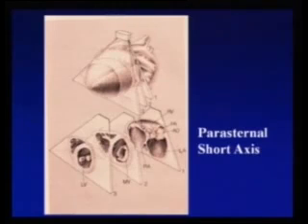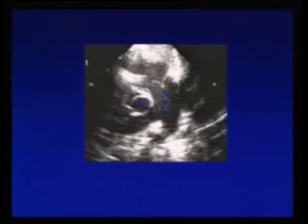The mitral valve has to be looked at in the short axis: is a cleft there or not, is the MR through the cleft or through the commissure. So any abnormality of the mitral valve can occur in congenital heart disease. Simultaneously we have to look out for these abnormalities. So short axis is important. With malposed great vessels you will get malposition of the great arteries, which I will show you later.